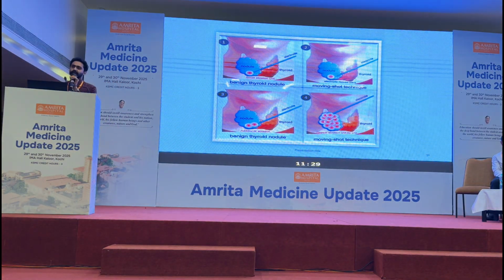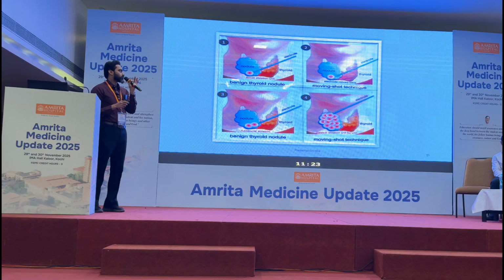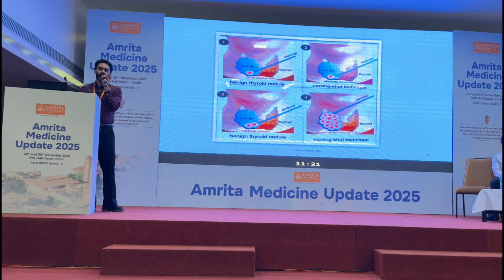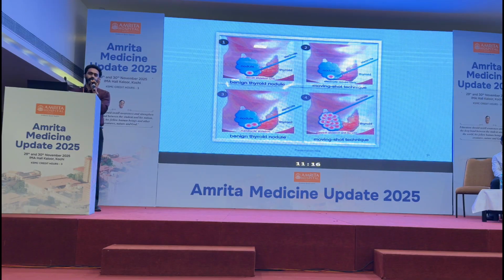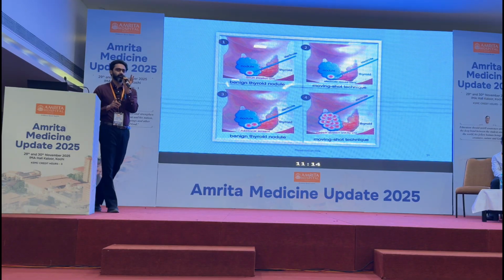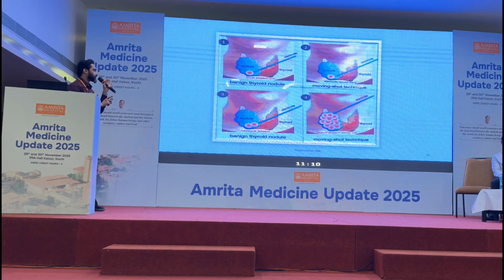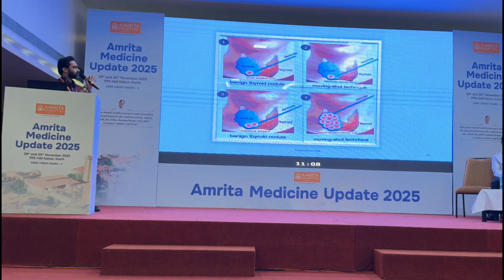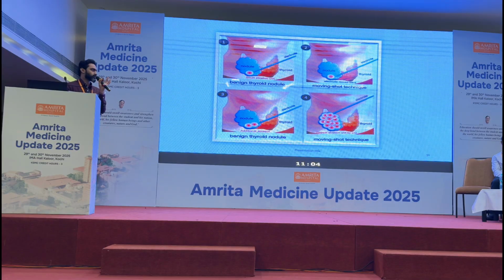Of late, we have also started doing ablation for thyroid. Thyroid ablation is done for benign thyroid nodules. We have to do at least 2 FNAC with a gap of 1 month to prove that the nodule is benign. So only Bethesda category 2 nodules can be ablated, and those lesions should be less than around 30 to 40 cc for us to ablate.